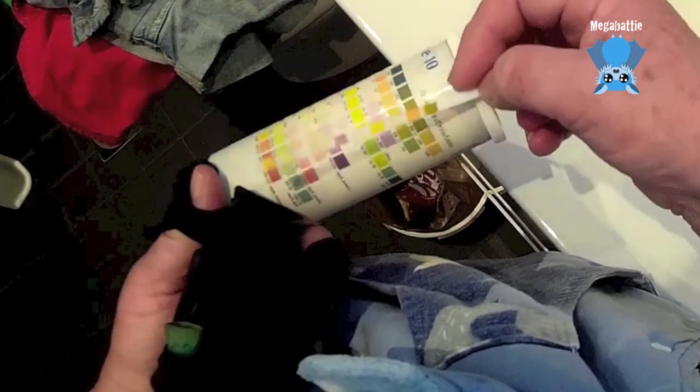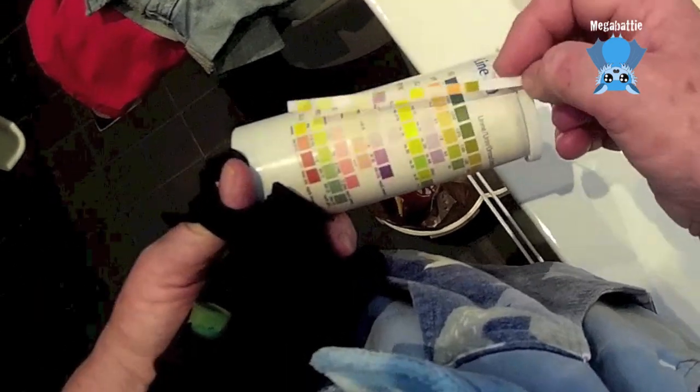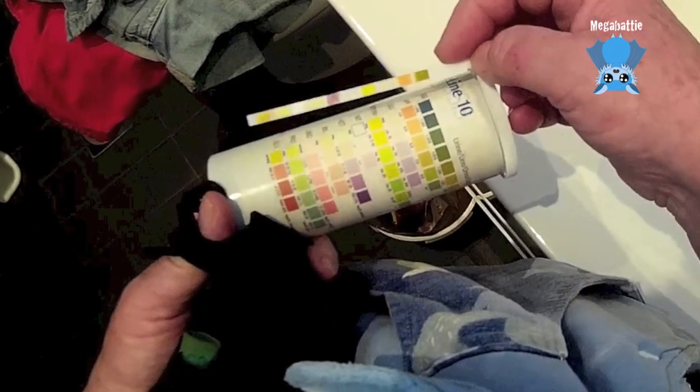You need a drink, don't you? That's why your urine is concentrated.